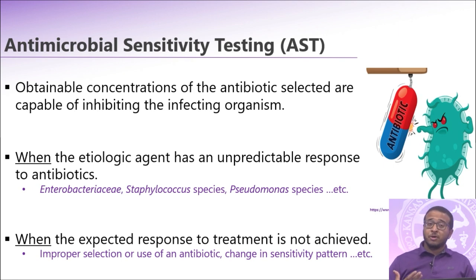Do we run antimicrobial susceptibility testing on all isolates that we recover from a clinical specimen? And the answer to that would be no, because some of those bacterial pathogens or fungal isolates that we recover from there are not going to be clinically relevant. They are not major players that are playing a role in this disease condition.